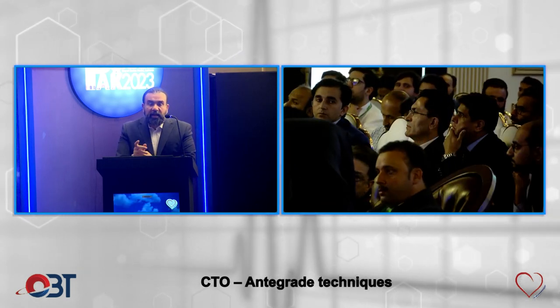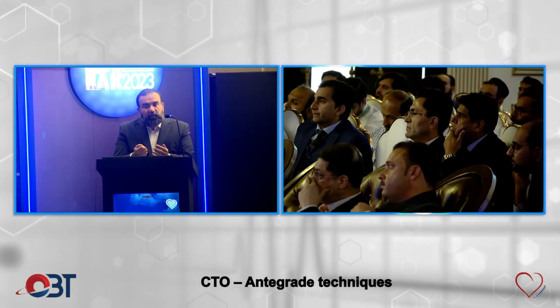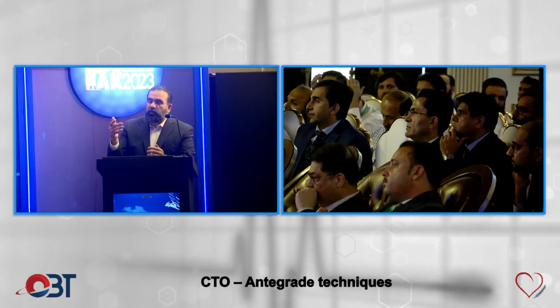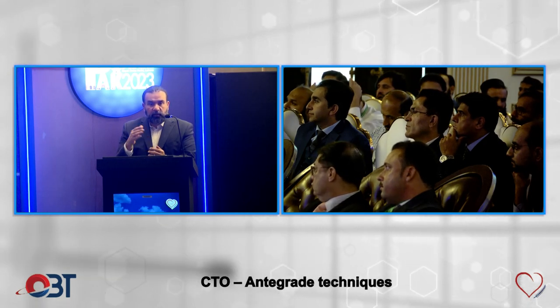The other thing you can do is you can actually do the classic dual wire, right? So aap sub intima mein hai, you can't do anything, aapke wire aapko pata hai ki the way the wire is moving, you do a retrograde injection, you stick in sub intima, you can then switch to a more traditional parallel wire technique and do it that way.